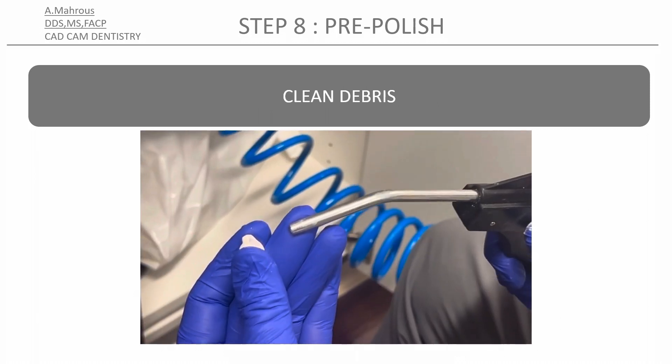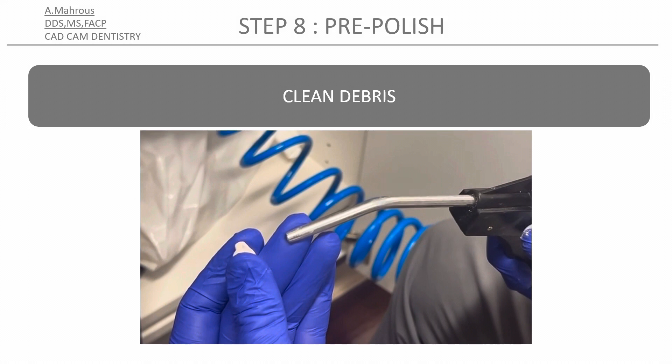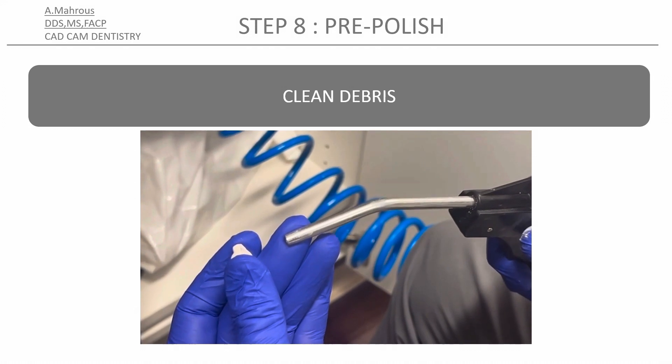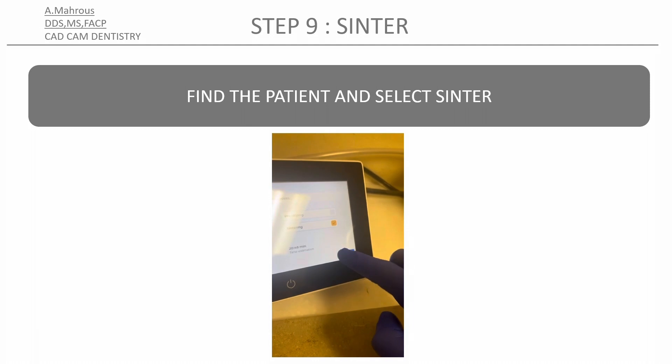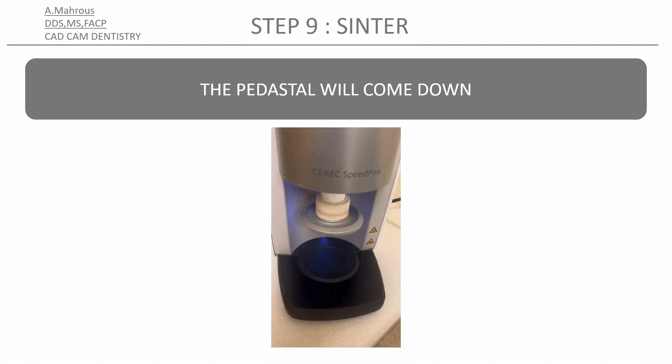Use some oil-free pressurized air to remove any debris from the crown before sintering. The speed fire should receive all the information about your patient, so go ahead and find your case, select sintering, and press play.